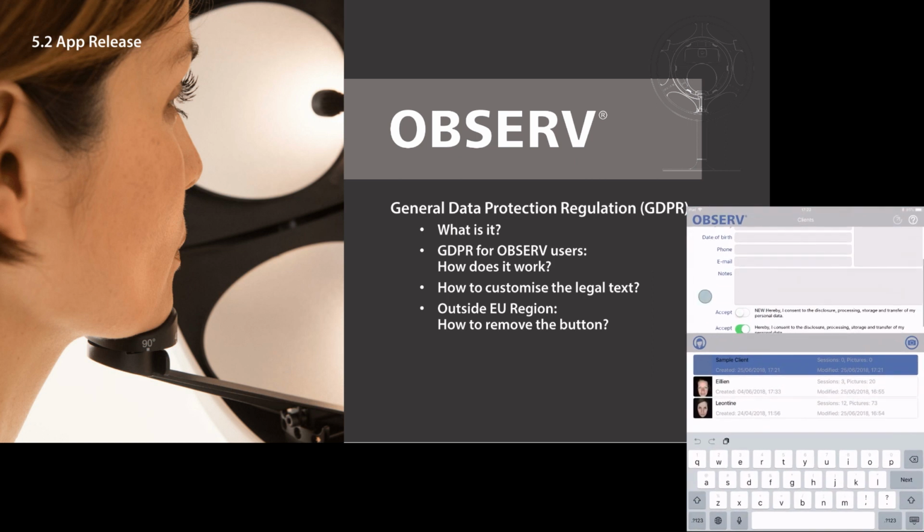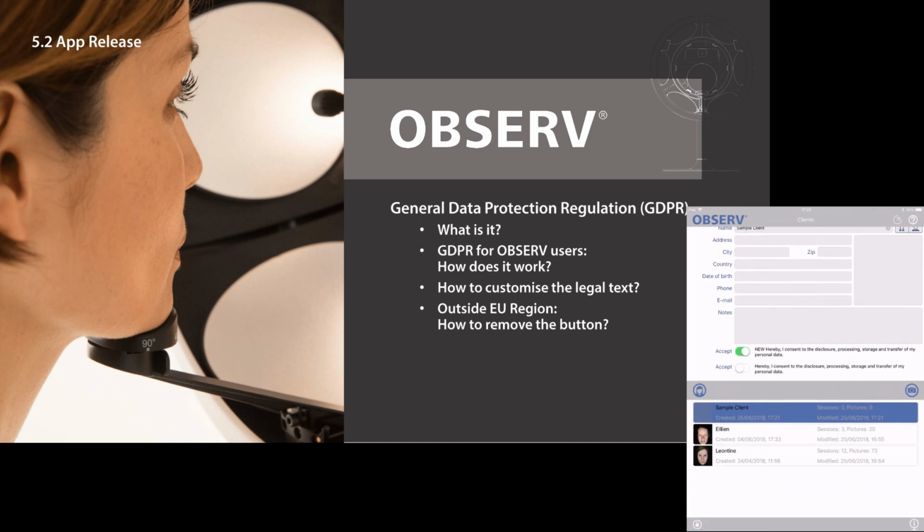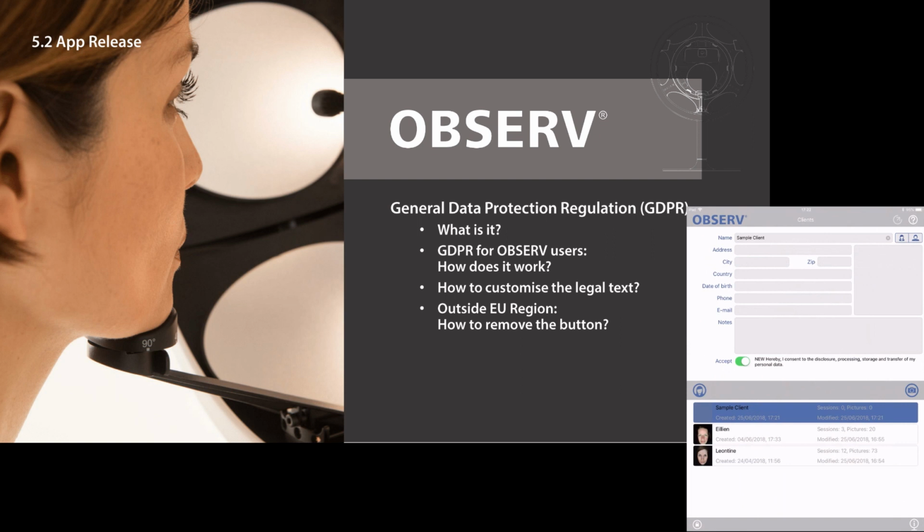Once you have modified the default text to your own terms and conditions, in case a client had already agreed to the previous legal statement, two buttons now appear on the client page. To proceed with the Observe consultation, clients have to accept the new terms and conditions. Once these have been accepted, the previous ones will disappear.